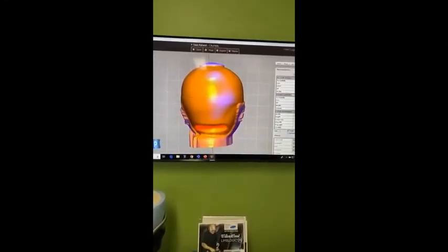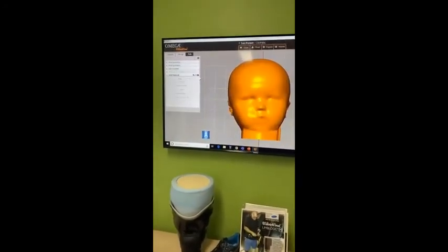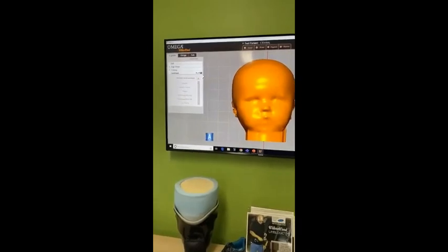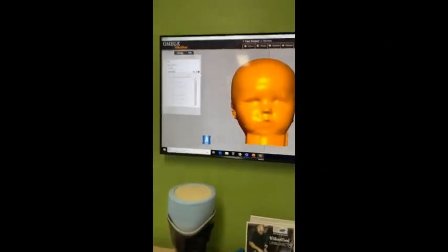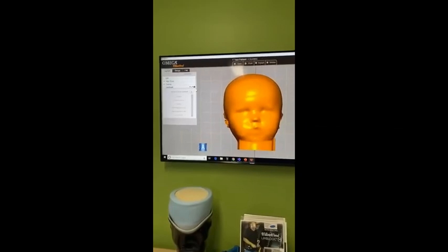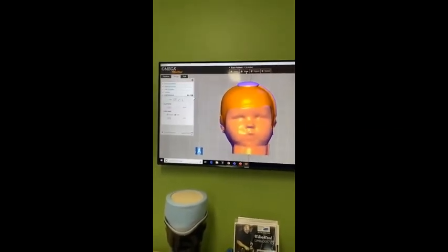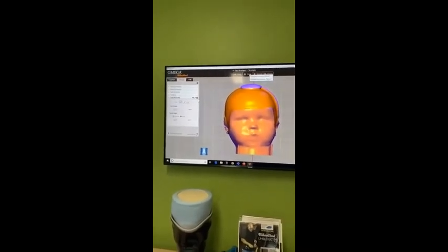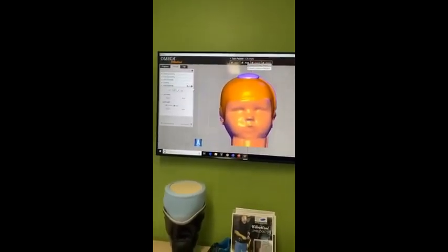So if you do label all your landmarks in the capture stack, if we labelled all these landmarks here, it would give us a CVA index measurement and reporting, which you can use for comparison scans and that. So you can print a cranial summary report and a cranial comparison report.